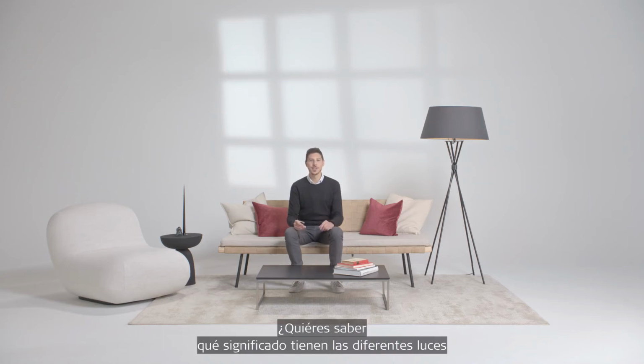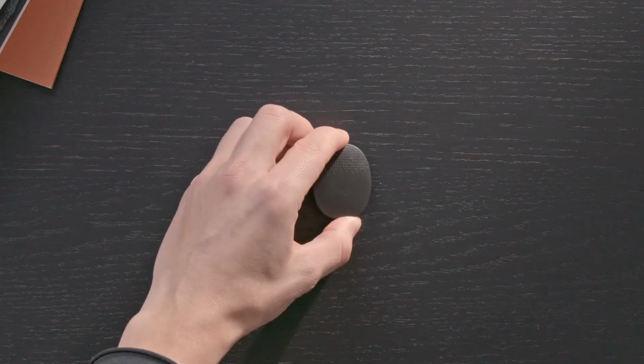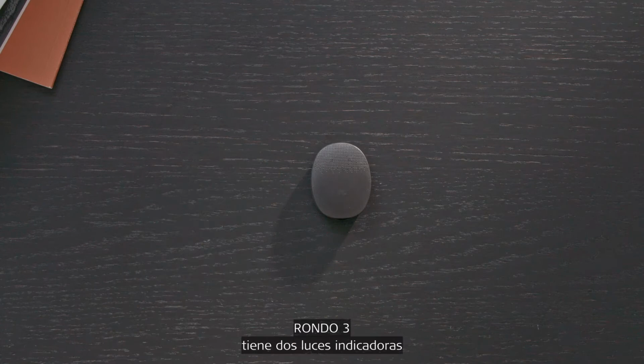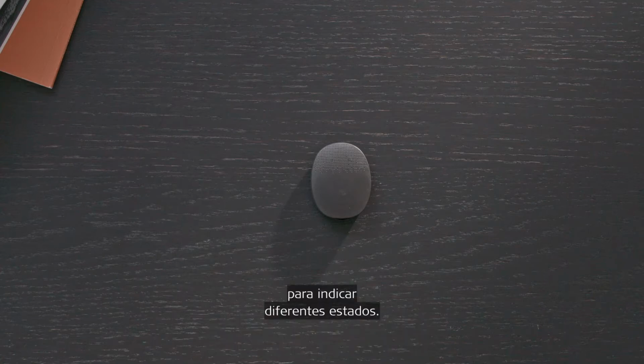Want to know what the different lights mean on your Rondo 3 audio processor? Let's take a look. Rondo 3 has two indicator lights which will illuminate or blink with different patterns and colors to indicate different conditions.